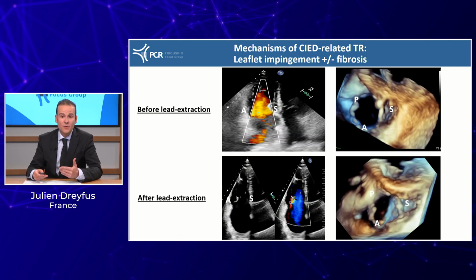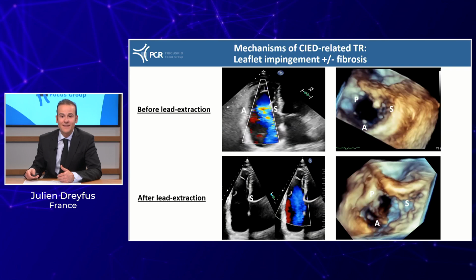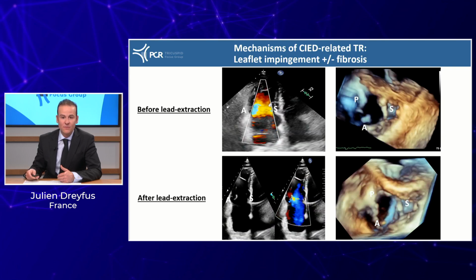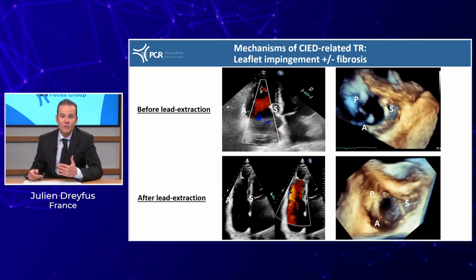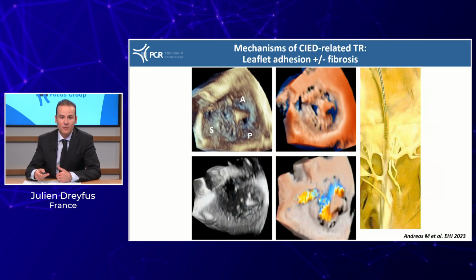And unfortunately, with time some degree of fibrosis may appear, so that even after extraction, sometimes you don't have a correction of the motion of the septal leaflets, which remain immobile.